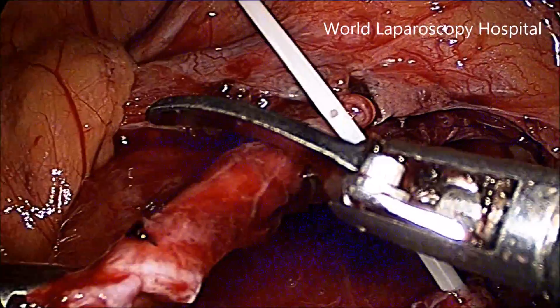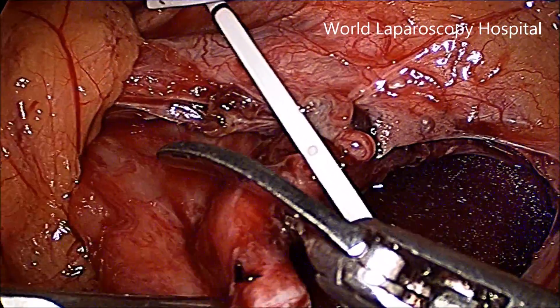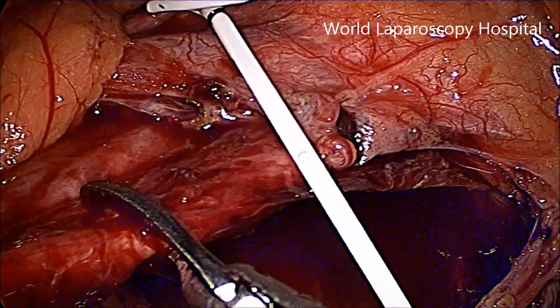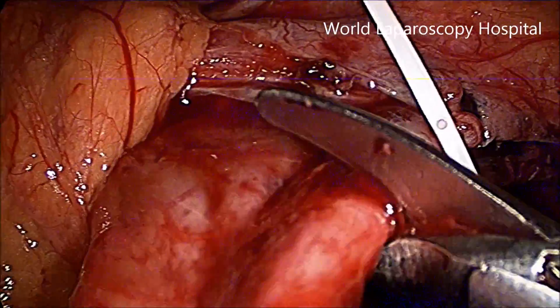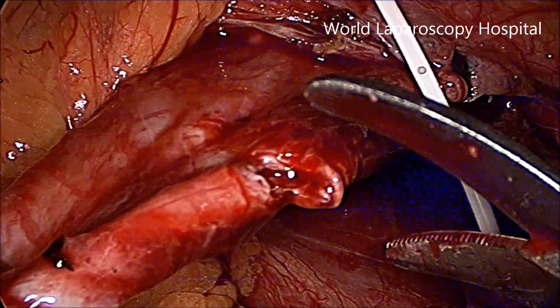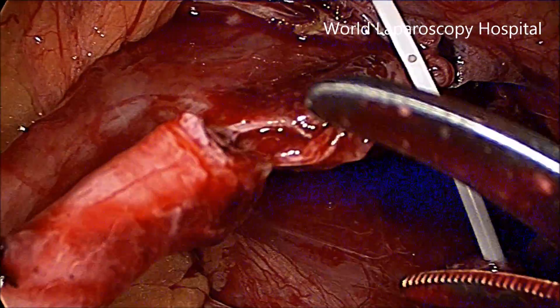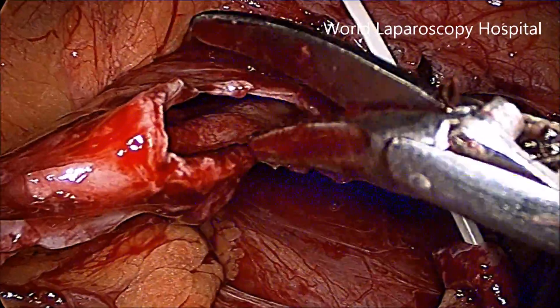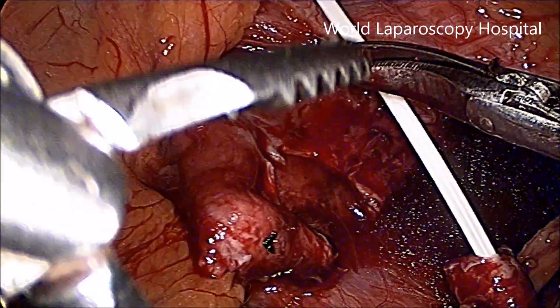Now this is the dilated pelvis which is cut. It is not necessary to cut it completely, because from time to time you can use the remaining stump as traction — just to hold it to help in the anastomosis.